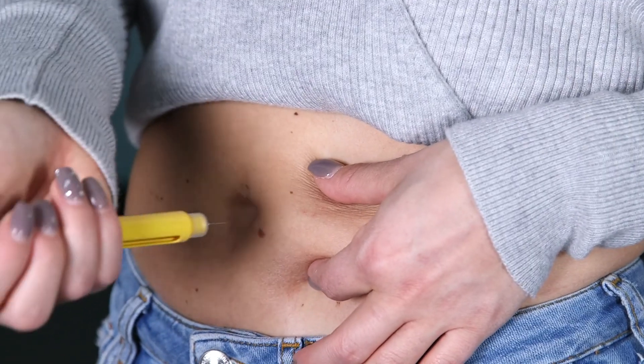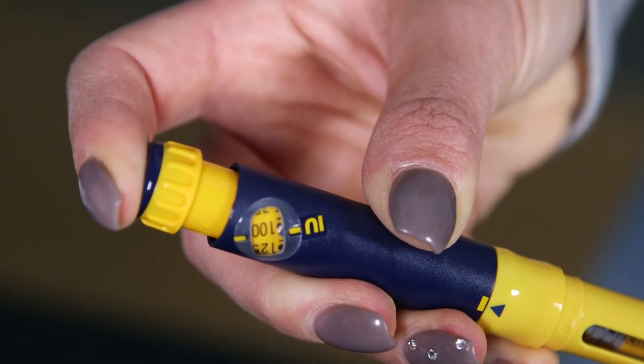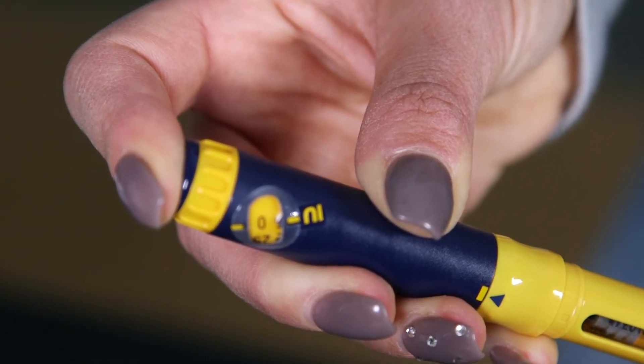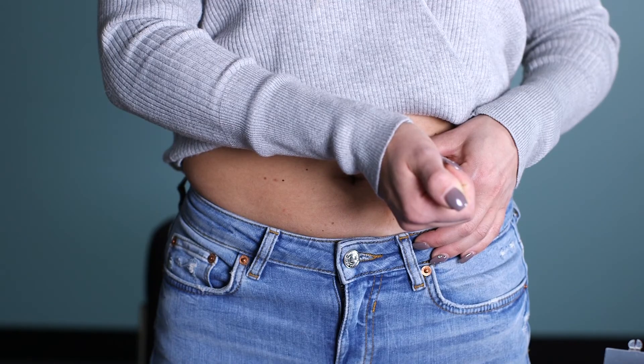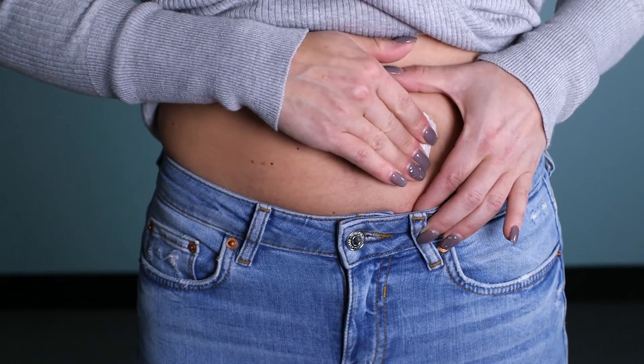Pick up the pen. The needle is going to inject the skin at a 45 to 90 degree angle. Depress the plunger and count to a quick five — one, two, three, four, five. Then remove the needle from the skin straight out. Use gauze or tissue if there's any bleeding.